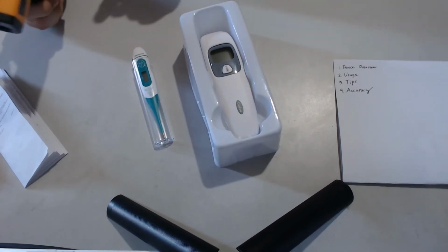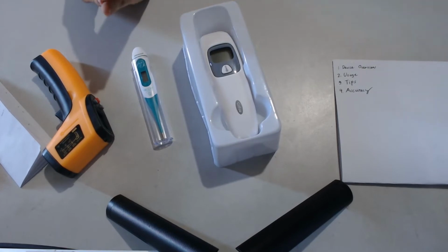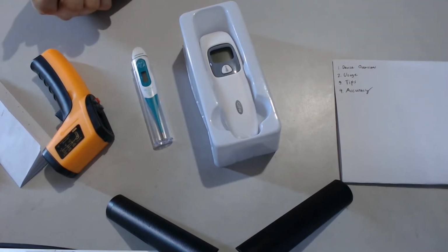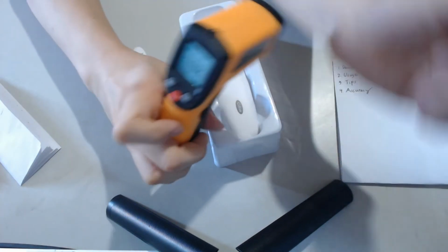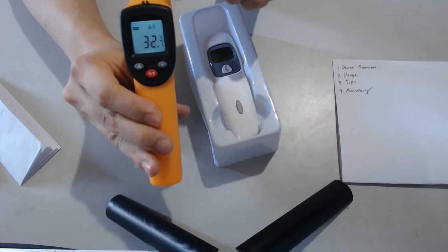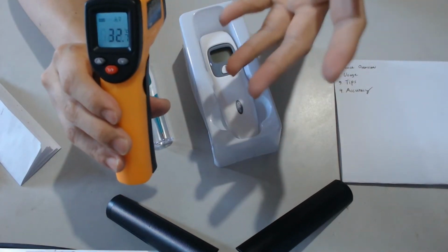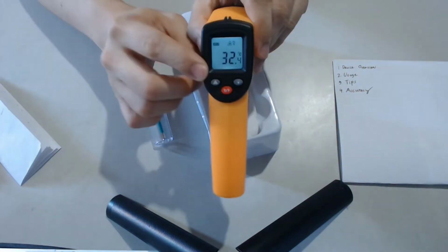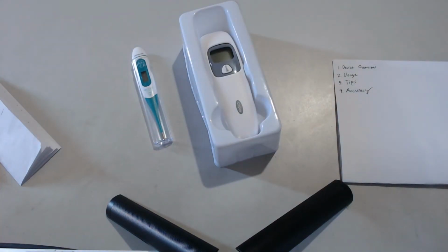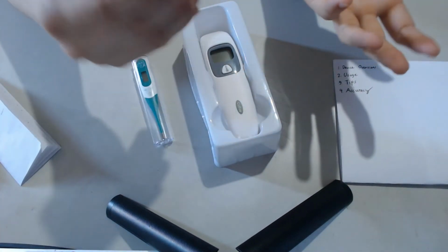One very important thing to note here is that the body's external temperature is different from the body's internal temperature. When we use this thing on my body like this, you get what we call the external temperature, and it's low. The teacher tells you from biology that the normal body temperature is from 35 to 37, but if you use this to take your own temperature, you get 32. Fine, I'll use my forehead. 34. I'm going to take the picture. I'm going to shoot my mouth.